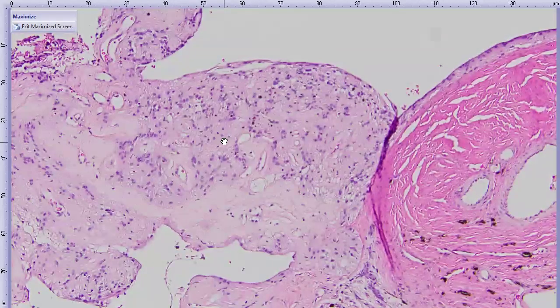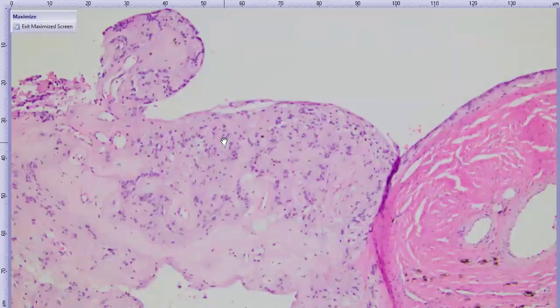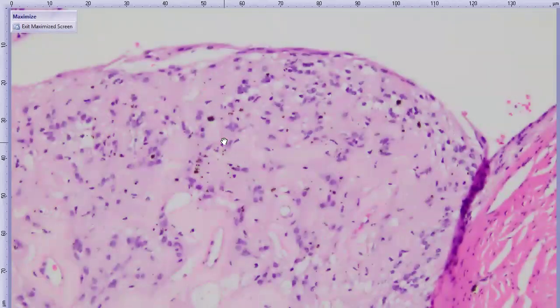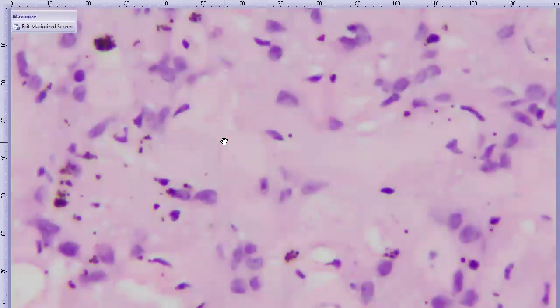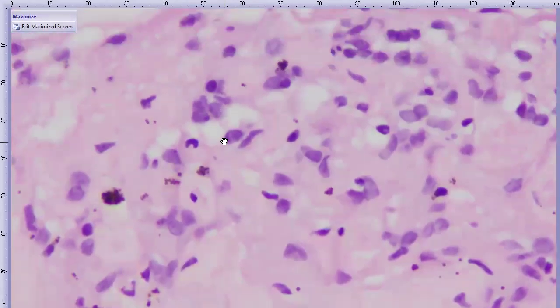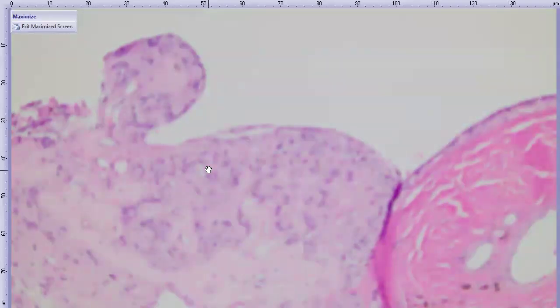This tissue, I think, is retinoid. It looks vaguely like primitive neural tissue. So we're lacking any of the layers that we would expect to see in a normal retina. There's a little bit of pigment around too. I wonder if the pigment granules are oblong. They may or may not be. If they were oblong, then we could posit that they were coming from retinal pigmented epithelial cells, but I think they're actually pretty round. So those are probably coming from choroidal melanocytes. Anyway, moving on. We'll just move to the opposite side of this cyst.